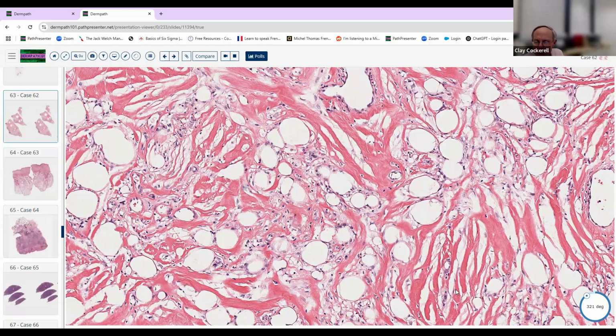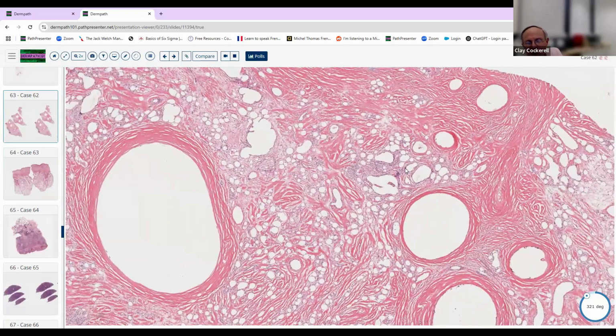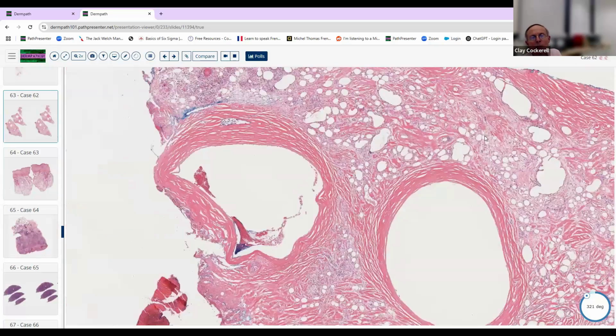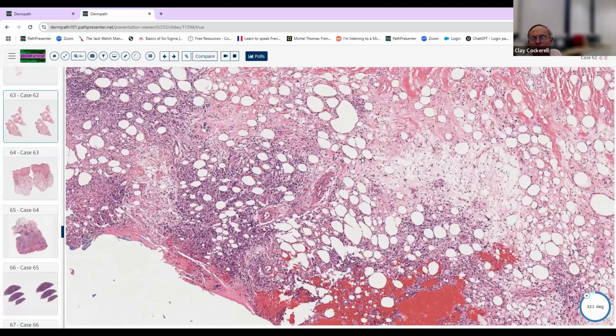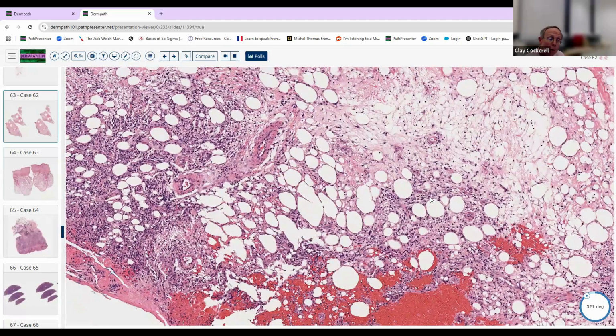This is an example of a paraffinoma, something that was injected by someone. So this is a factitial disease. It doesn't look like a classic inflammatory process. So when you see something like that, you should think about factitial. And these people inject all sorts of things in their skin. They can inject oils, they can inject silicone, they can inject real paraffin. If you polarize this, you might see polarizable material. So this is an example of a paraffinoma.